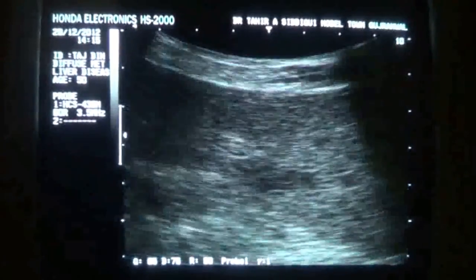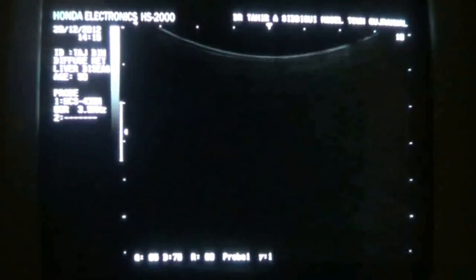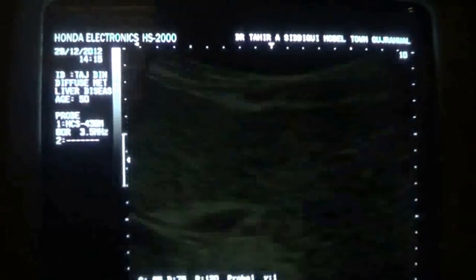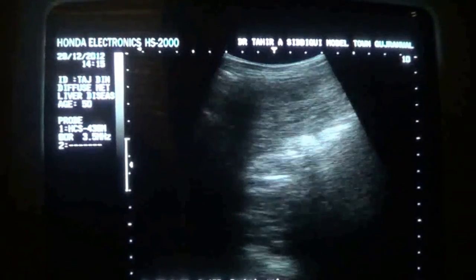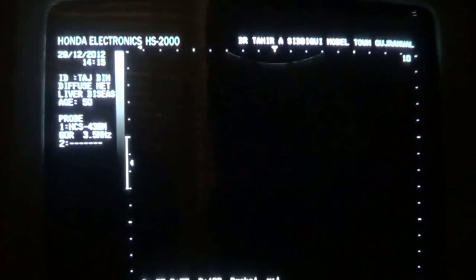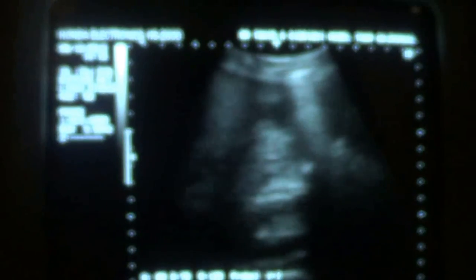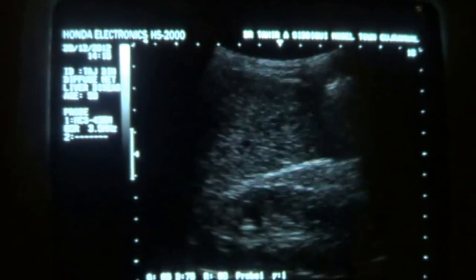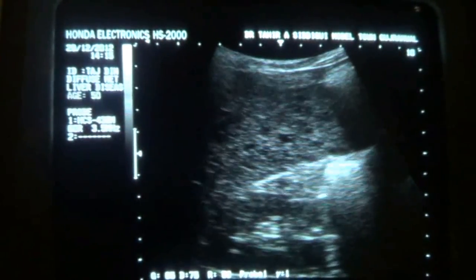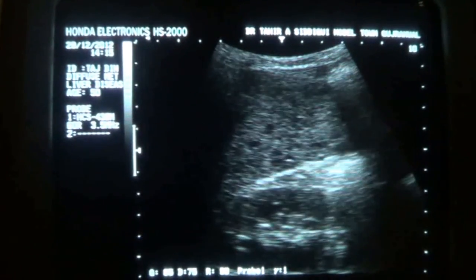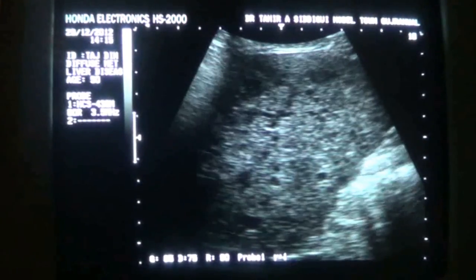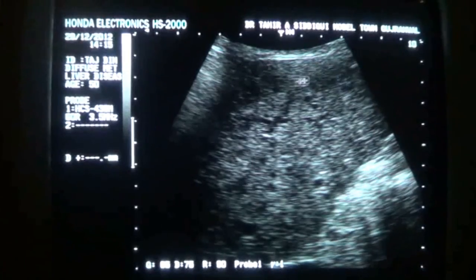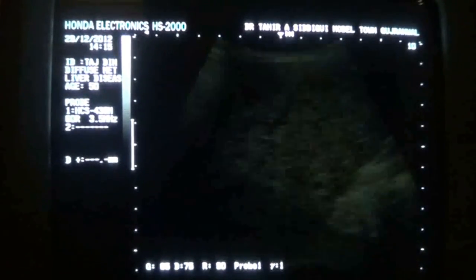The liver is enlarged. I can see it below the costal margin. Now I am giving a sweep below the costal margin and I can see the liver below the costal margin. This is the kidney. The kidney is normal. And you can see the liver — above the kidney, uncountable hypoechoic lesions are seen.